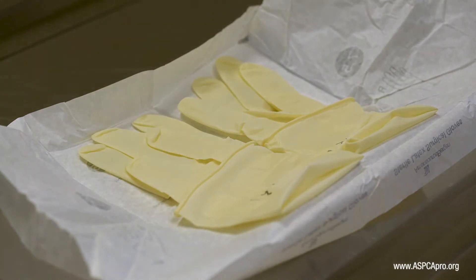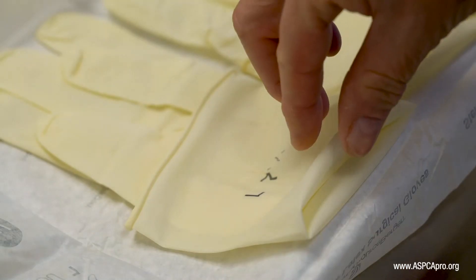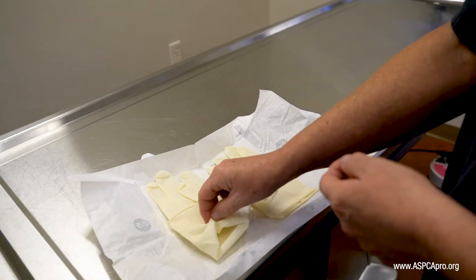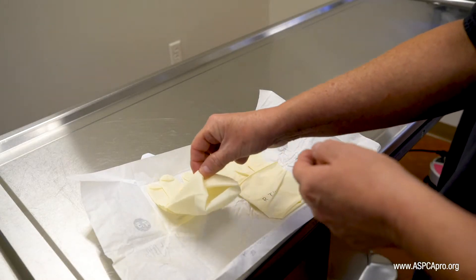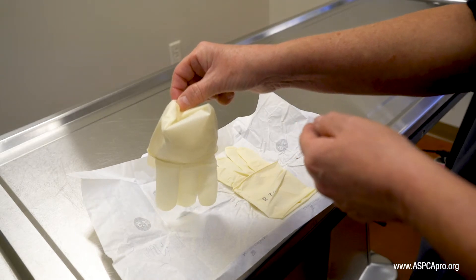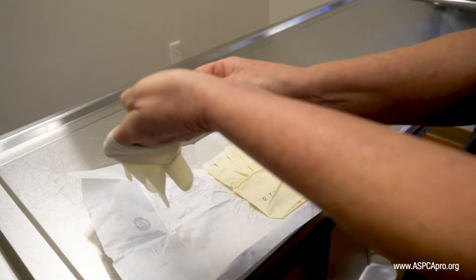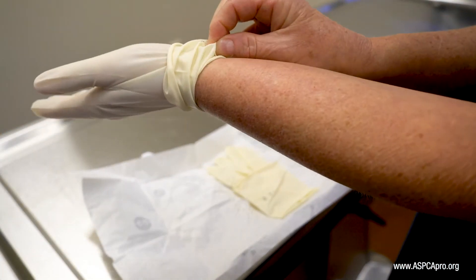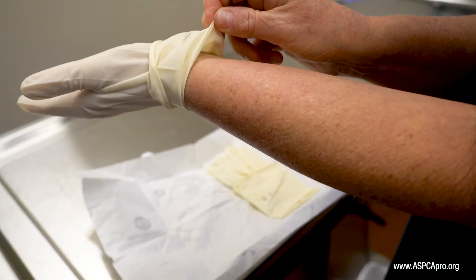Choose your first glove and grasp the top of the folded cuff to pick it up, using care not to touch the paper. Carefully slide your hand into the glove, ensuring the fingers do not flop back against your hand, arm or any other surface, and all the while keeping your unsterile hand on the unsterile portion or outside aspect of the fold.